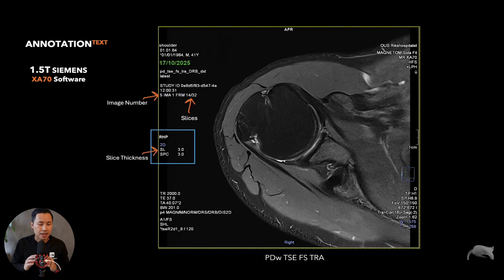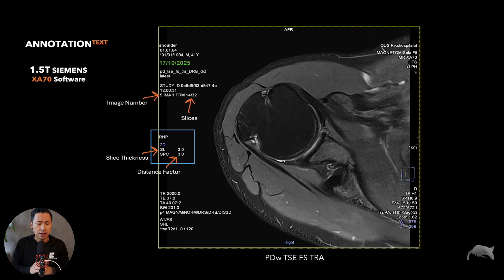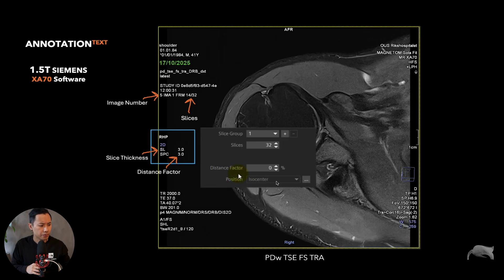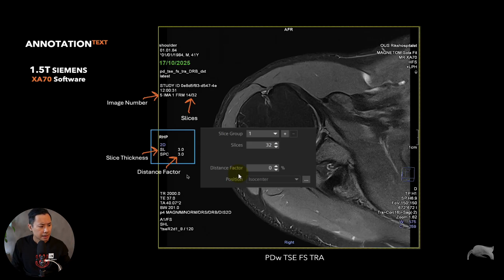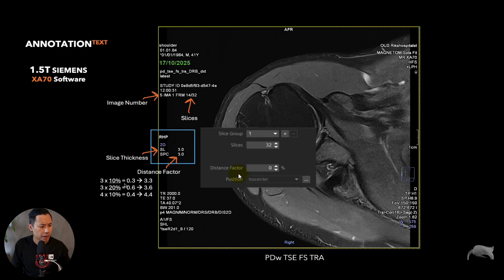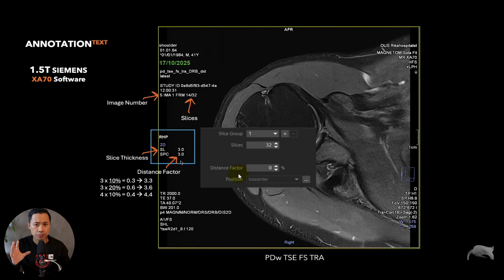Here is slice thickness - 'SL' means slice thickness, so this is 3 millimeters. Then the distance factor - how can you determine the distance factor? If you write zero it will of course be zero distance, and in the setting here it says 3.0. If you use 10 percent you take 3 millimeters times 10 percent, which is 0.3, and 0.3 plus 3 millimeters equals 3.3 - so if you use 10% it would say 3.3 there.